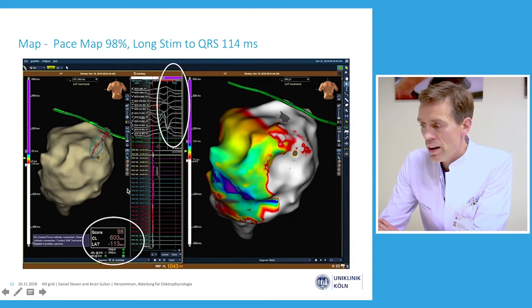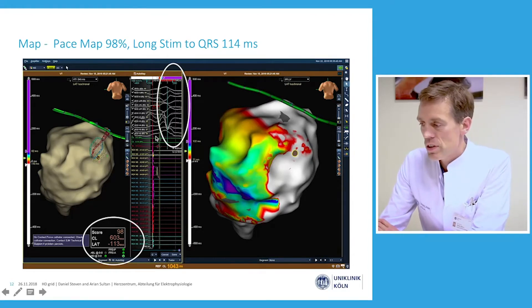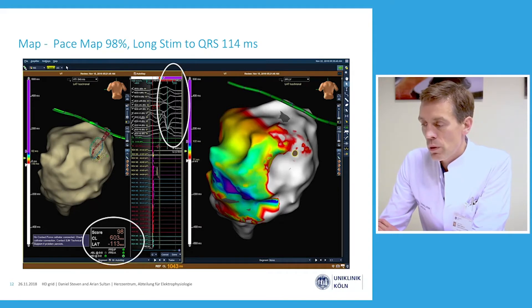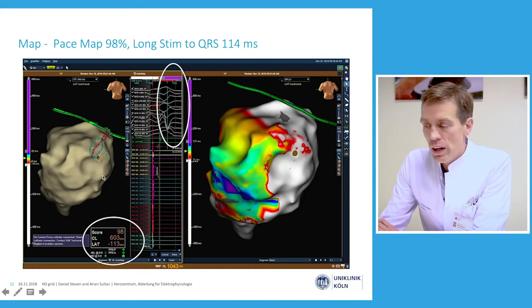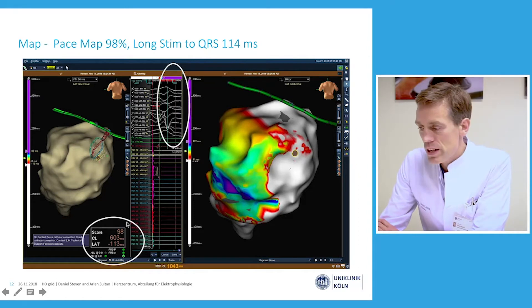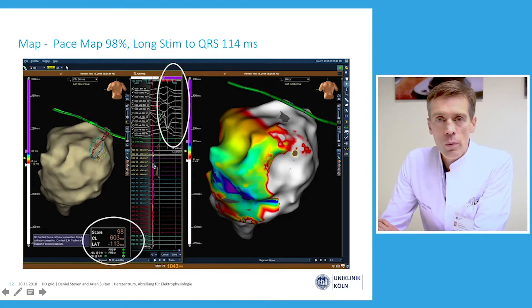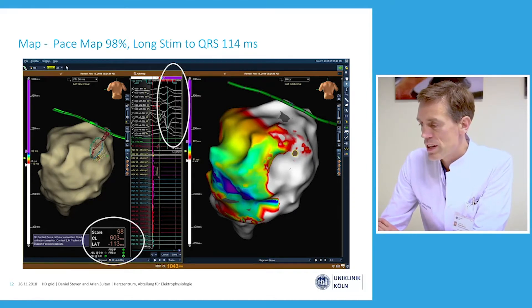When we mapped the tachycardia — since the patient was hemodynamically sufficiently stable — we were able to obtain a propagation map of this tachycardia, with one of the pacing sites located within this slow conduction, low-amplitude area. Pacing via one of the bipoles of the Orion grid catheter, we achieved an overlap with the clinical VT of 98%, with a very long stim-to-QRS interval in the area where the slow conduction signals were obtained.